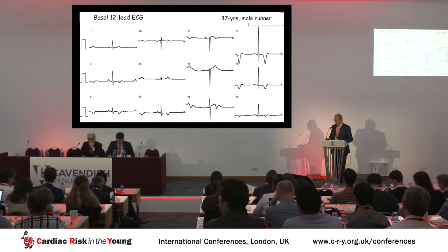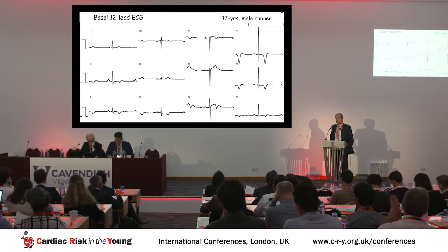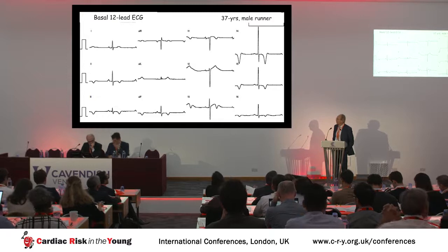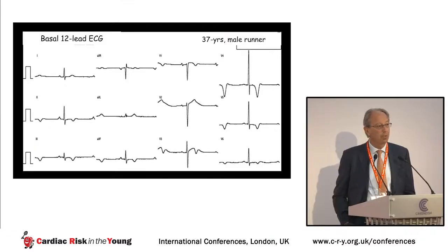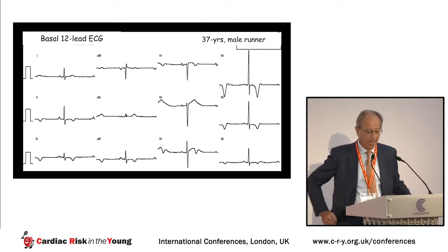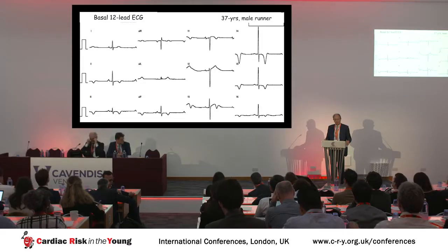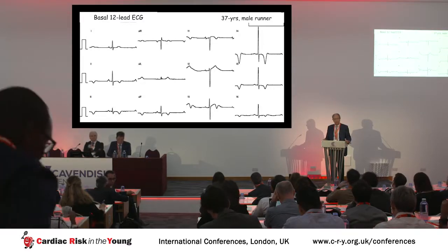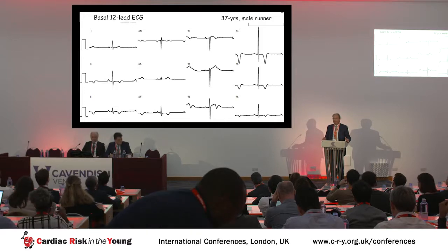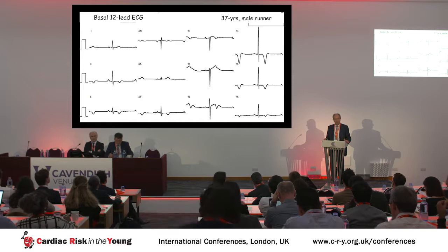devote to this particular issue, the electrocardiogram, and particularly the abnormal electrocardiographic pattern consisting of inverted wave in lateral leads, or mostly inferior in the lateral leads. I appreciate this kind of approach that Michael and the other people suggested for this topic, because this is very practical. And according to the location of the inverted wave, we should have a different approach.